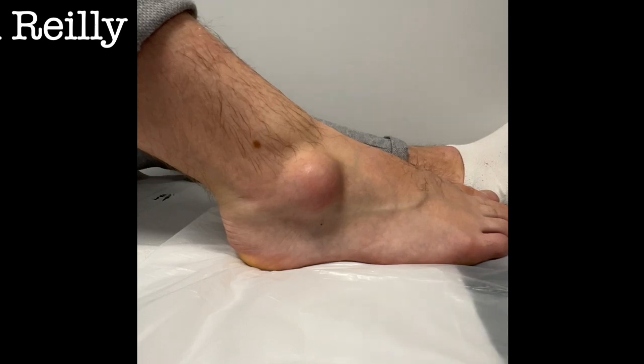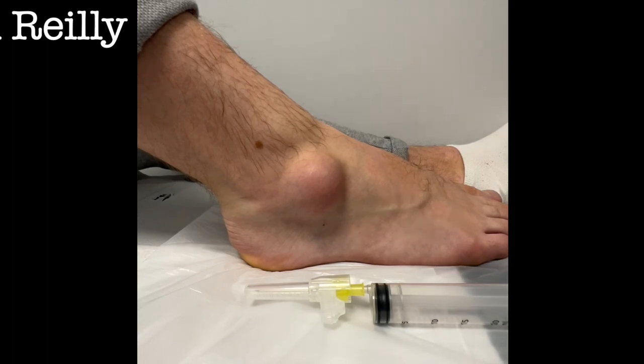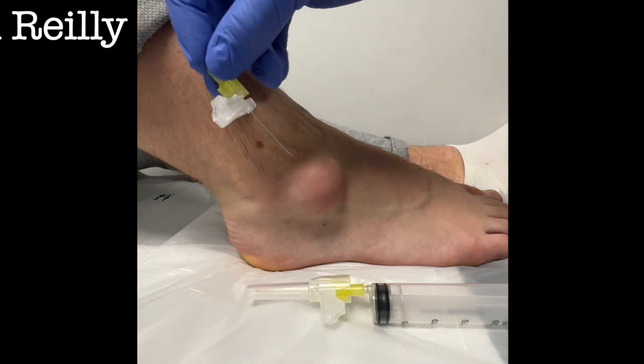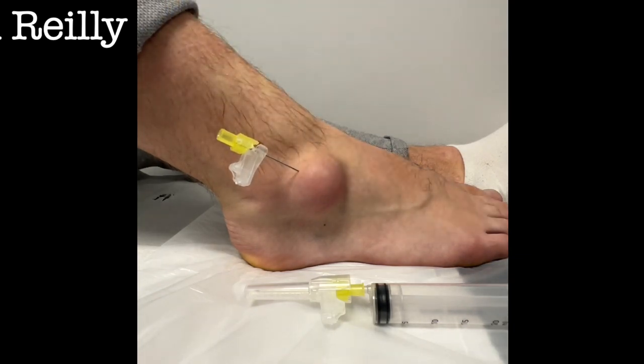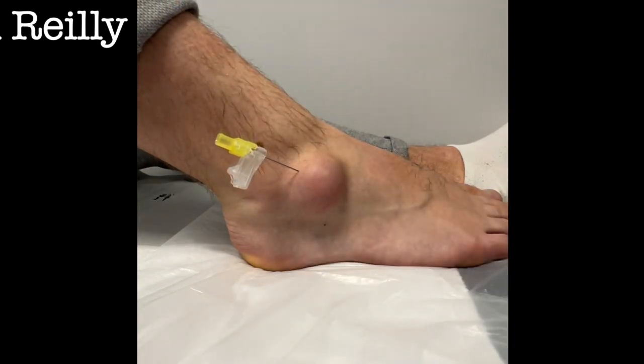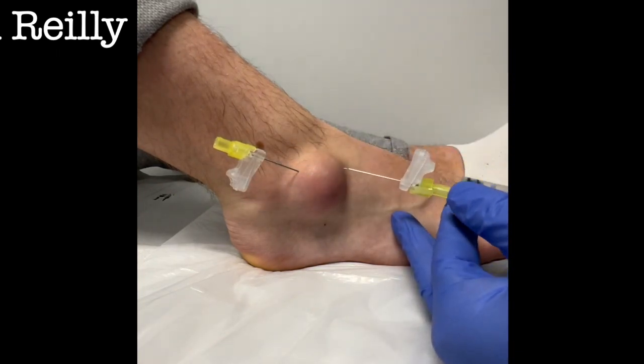We're going to drain some fluid off for you, which takes the pressure away from the lesion and makes it feel better. What I like to do with these is use a fairly chunky needle, and I'll often do a little scratch — three, two, one — just to kind of break the seal, and then we'll see how much we can get off. The secret is to use the biggest needle you've got because it's goopy stuff.